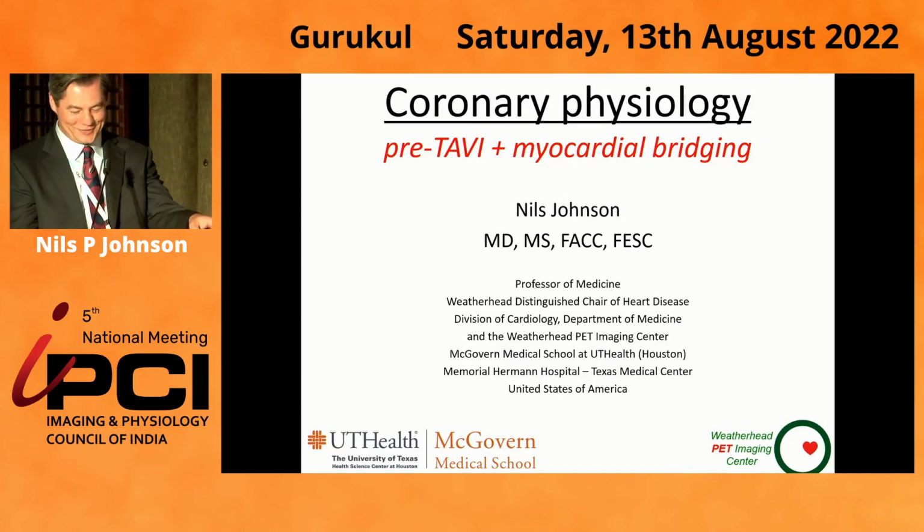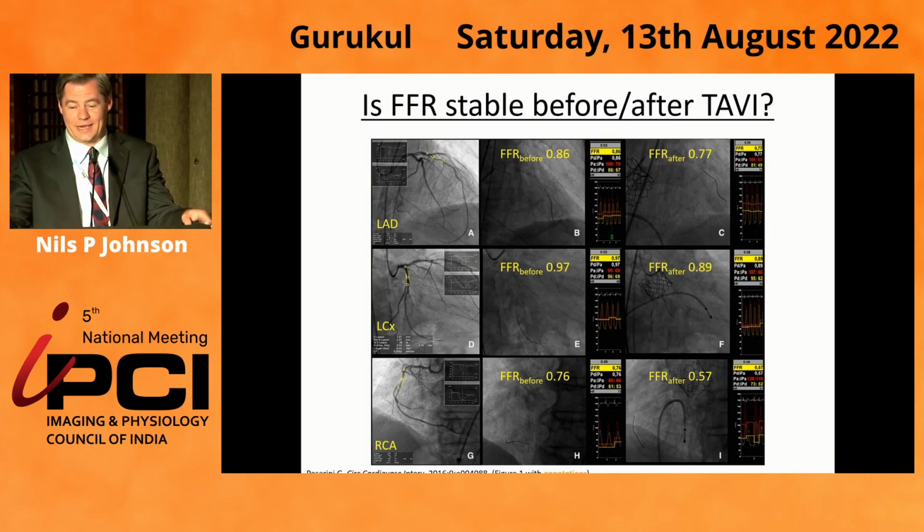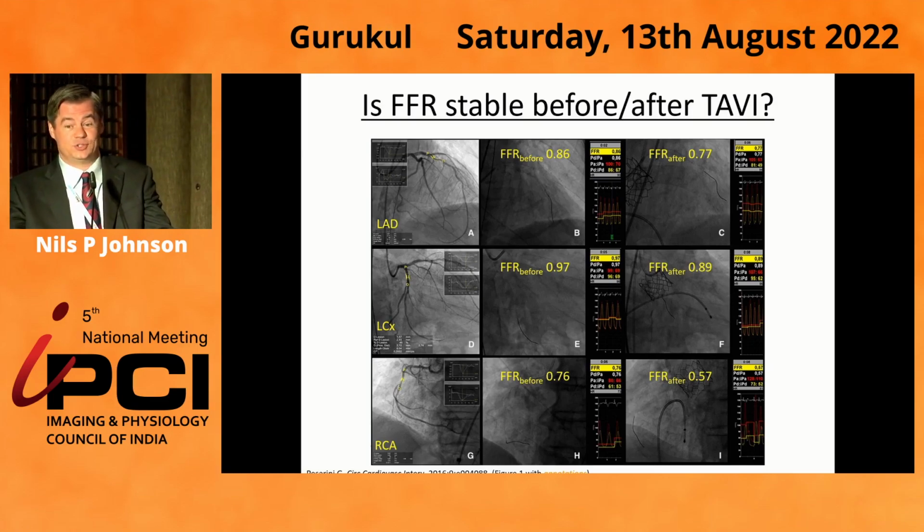And now for something completely different, as they say. So here's the eye-catching slide that I think got a lot of people's attention several years ago. As you can see, there are 3 different patients. FFR was assessed in these vessels before and immediately after TAVI, and you can see that the FFR values change.